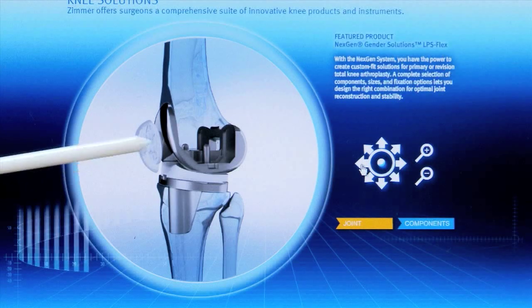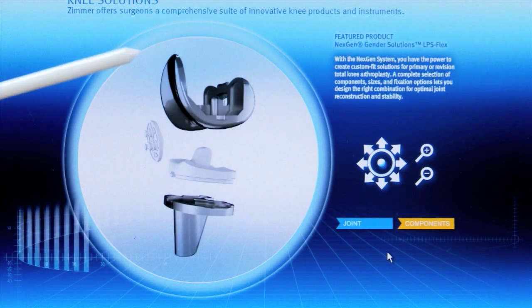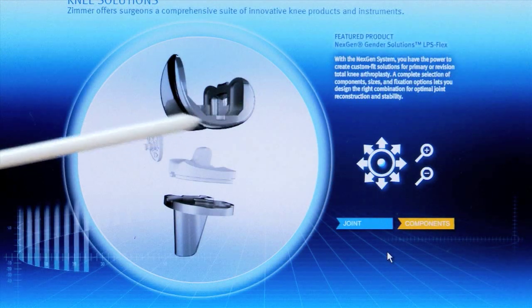Sometimes you can replace the kneecap with a plastic button — you don't have to do that all the time. And if we break it up, that's it off the bone — so that's the cobalt chrome femoral component.